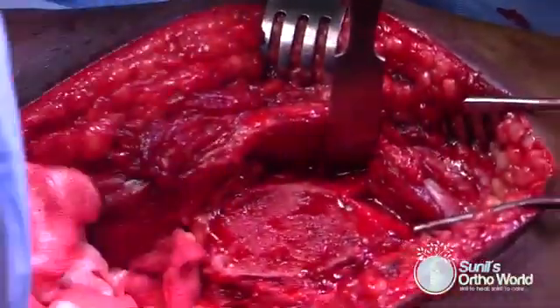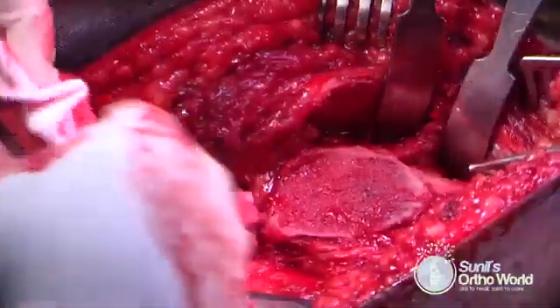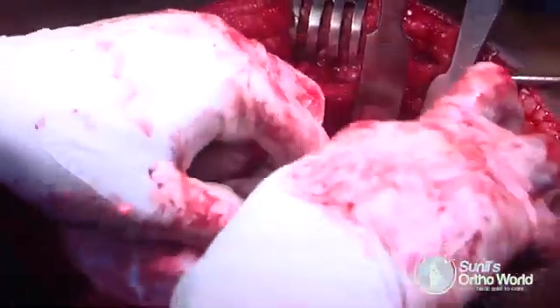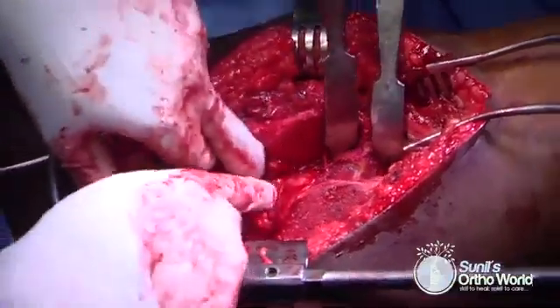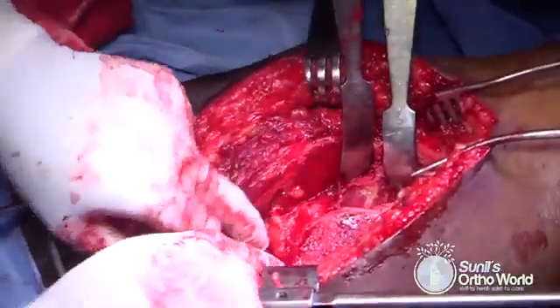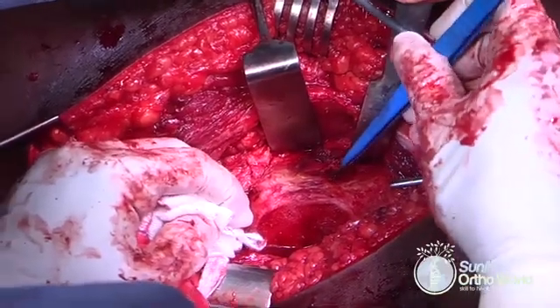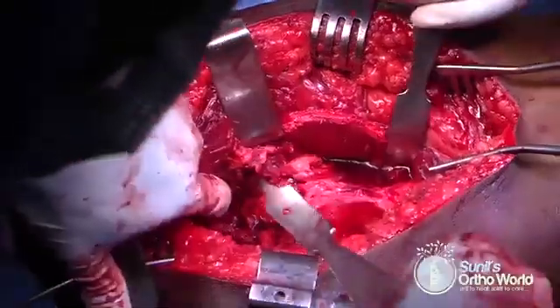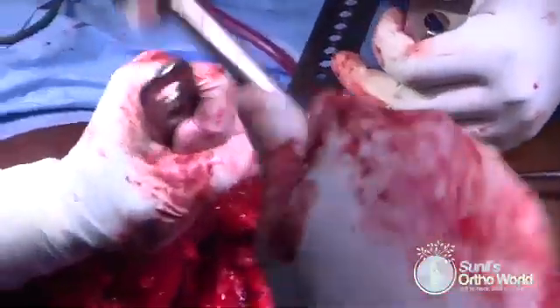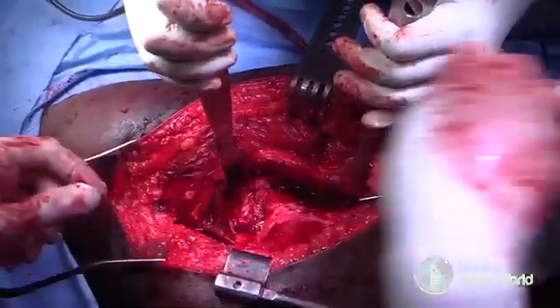Spiked Hohmann retractors are placed anteriorly to retract the osteotomized fragment and the limb is brought gradually into a position of flexion and external rotation to expose the anterior capsule. Further dissection is performed to expose the entire anterior, superior, and inferior capsular region. A spiked Hohmann retractor can be hammered into the anterior column to retract the anterior soft tissues.